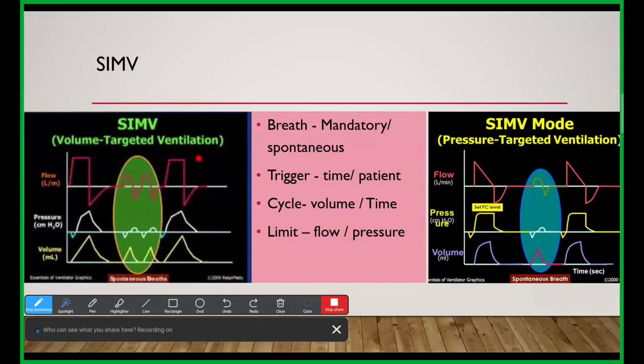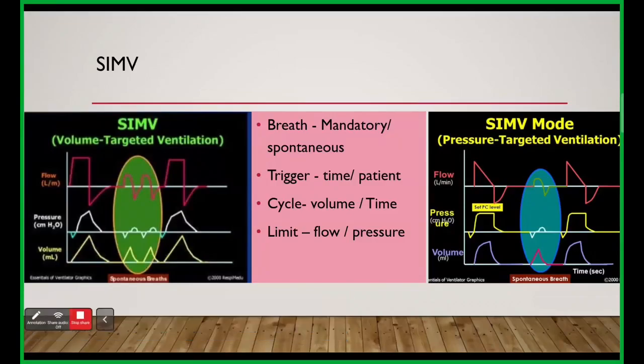So breaths can either be mandatory breaths or spontaneous breaths. Trigger: time trigger, that is machine triggered or patient triggered. Cycle: volume or time triggered, time cycle, or flow or pressure according to the mode set.